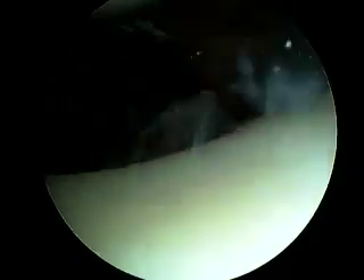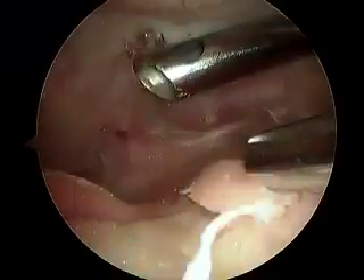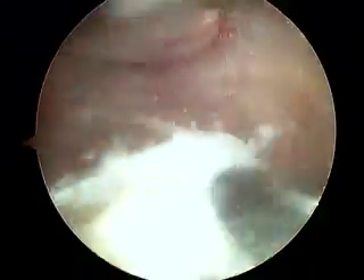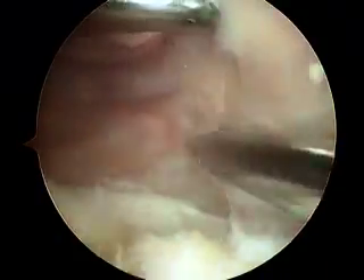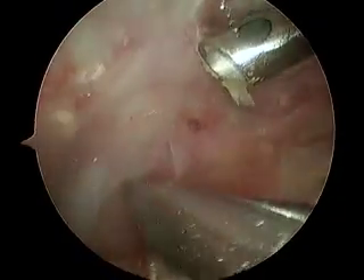Not much doubt about what's going on here. It's everywhere. This tissue right here is all inflamed and irritated by the crystals. This is synovium tissue in your knee, and this is why your knee feels kind of boggy and swollen — because this tissue is all swollen. I'm just going to get rid of some of this red irritated inflamed tissue in here and that will make you feel better.